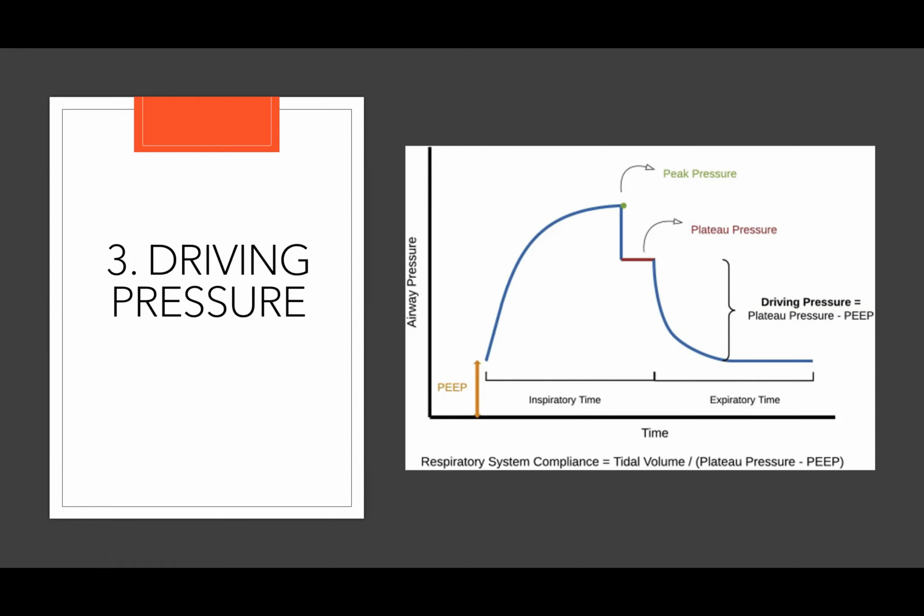So this is what we can think of as being responsible for that atelectrauma and probably some of the barotrauma as well. So why am I going on and on about driving pressure? Because this is somewhat of a newer concept. Now, the reason is because it seems to be important, obviously.